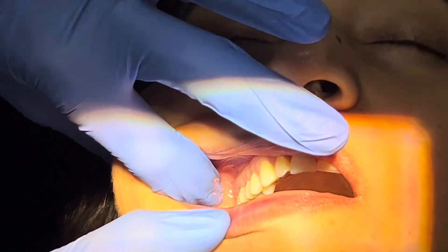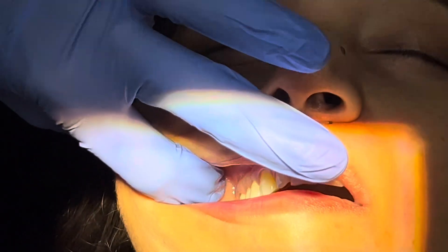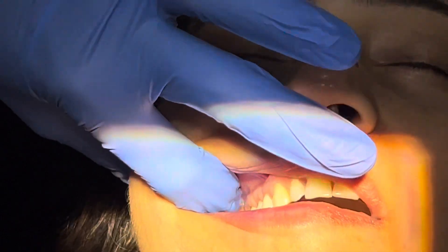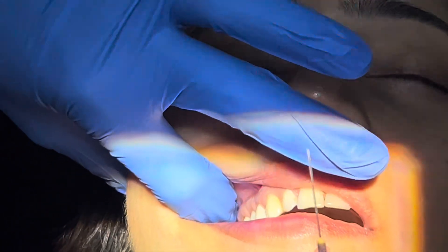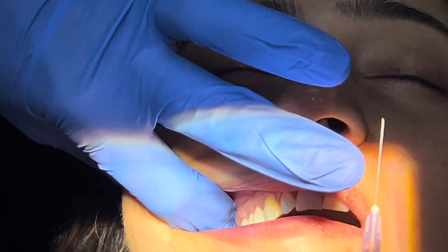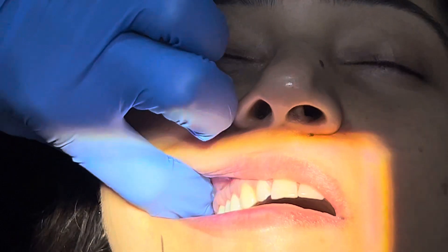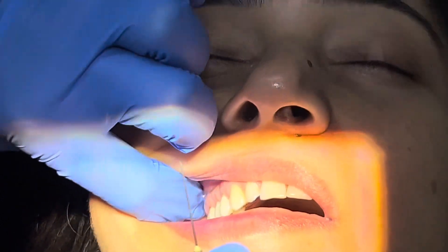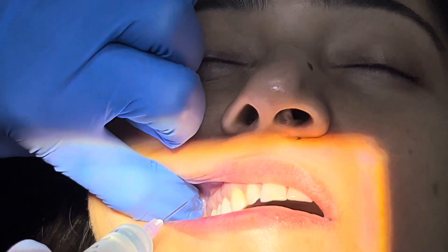Here we retract the mucobuccal fold — just close down a bit, yes. This is the depression in which we need to insert our needle. For the PSA, we need to insert around 16 millimeters of the needle, which will be two-thirds of the needle. The penetration point will be above the second molar, and we need to penetrate at 45 degrees.